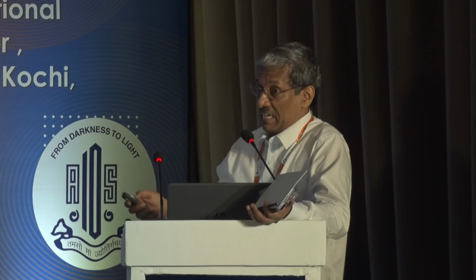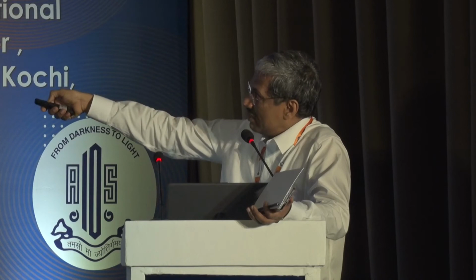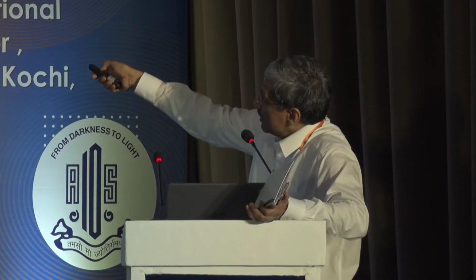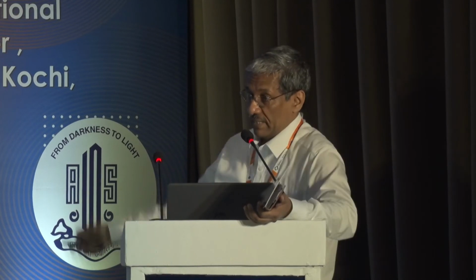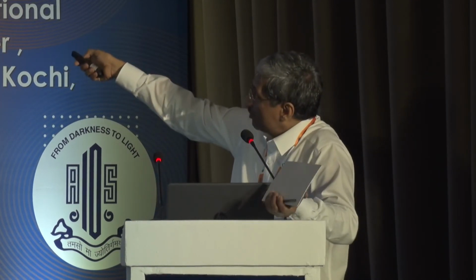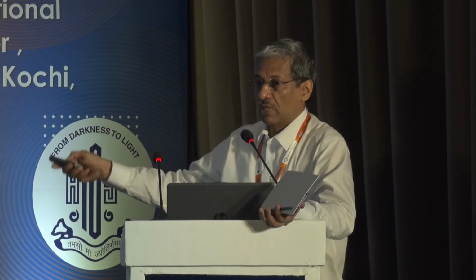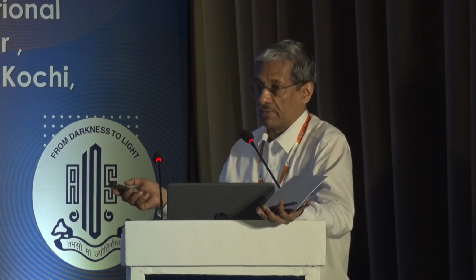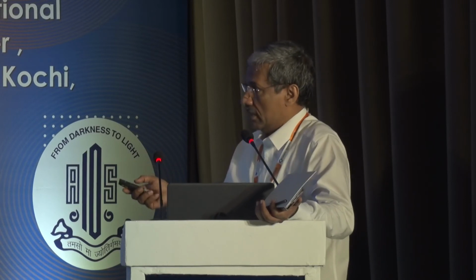Now, once in a while, very rare, you'll see a lens where the posterior curvature is not normal. There's some kind of thinning, weakening, and bulge. See this. There's a small tear in the posterior capsule. This patient developed a mature cataract after several anti-VEGF injections. He just came to me with a mature cataract, but this was picked up by the optometrist. So this kind of data is really useful because you can plan your surgery and what you tell the patients. So central topo is very good if you have a large refractive practice and sufficient volumes, and I wish they would give it free with each IOL Master 700, but it's a good add-on feature.